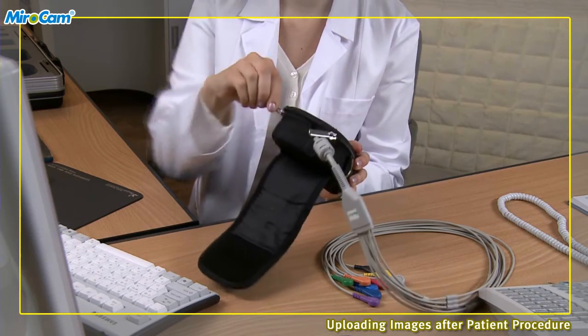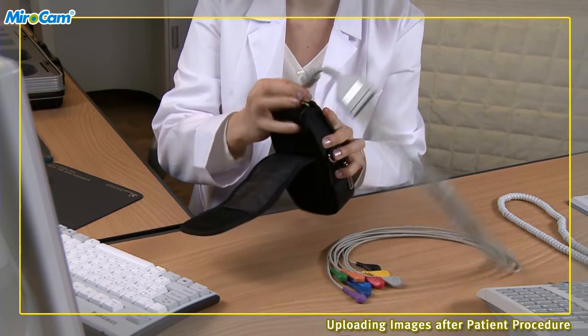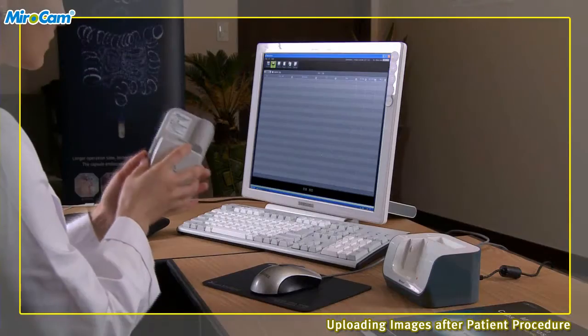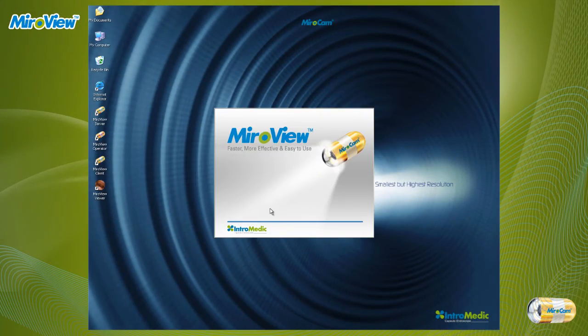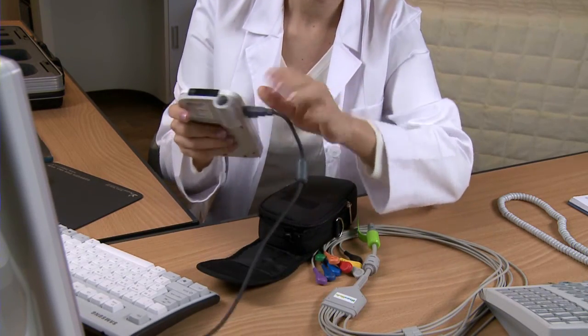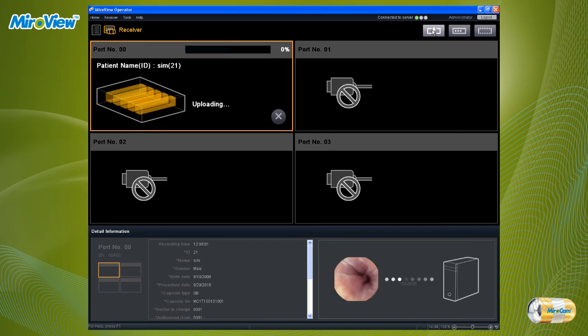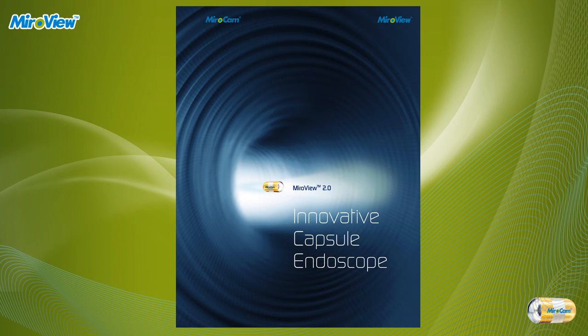Uploading images after patient procedure. After finishing the procedure, the patient should return the receiver to the hospital. Take the receiver unit out from the receiver pouch, detach the data cable and battery from the receiver, and place the battery in the charger. Start MiroView Operator and log in. Connect the receiver to the computer via USB cable and turn the receiver power switch to the on position. In MiroView Operator, click on the receiver mode icon to manage the receiver. Click the upload button, and when the progress bar is full and the complete message appears, the upload is complete. MiroView server will automatically start the analysis process for the corresponding patient file. This was a quick introduction of MiroCam capsule endoscope procedure.